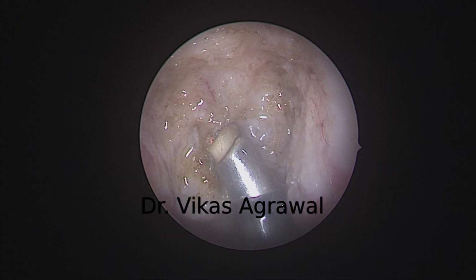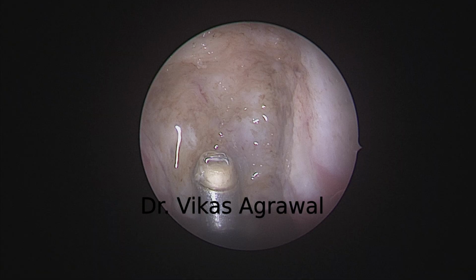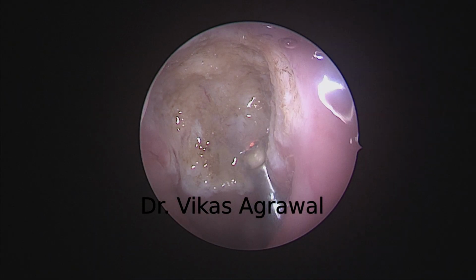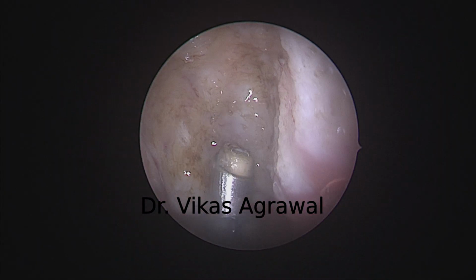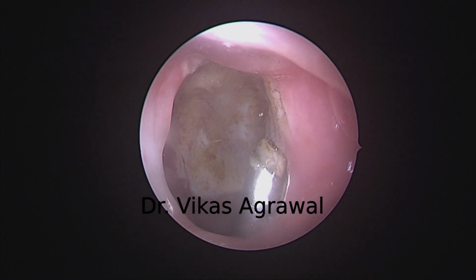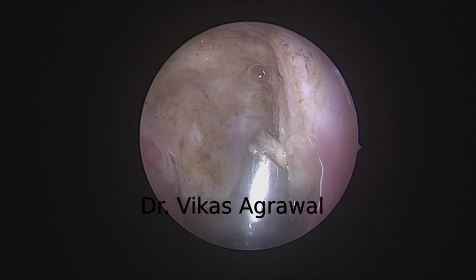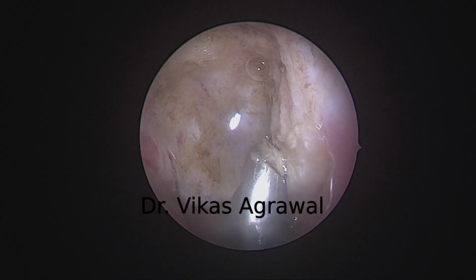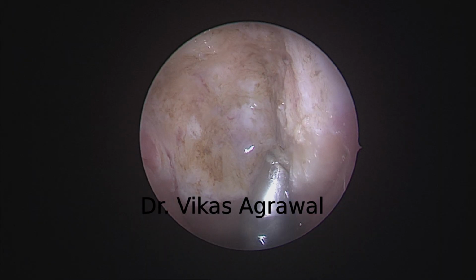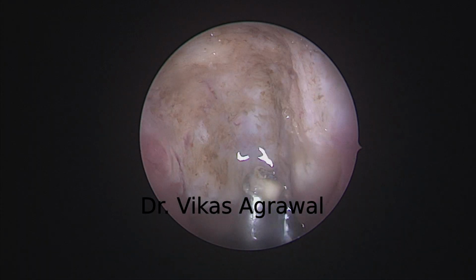And whatever little lymphoid tissue is still over there, do not open up the fascia, just remain close to the fascia. If you open up the fascia, the child will have pain on lifting the head for a couple of weeks. Obviously, you do not want it. Now, whatever little tissue is there on the torus tubarius, if you do not want to ablate, you can simply coagulate so that the active lymphoid tissues will not be left anymore. They will fibrose.